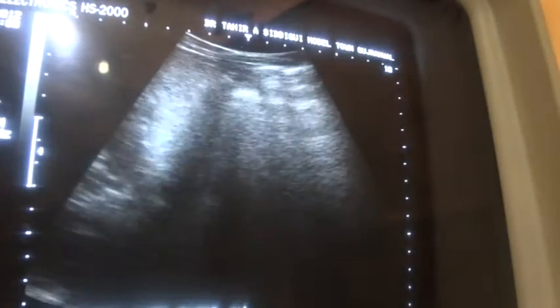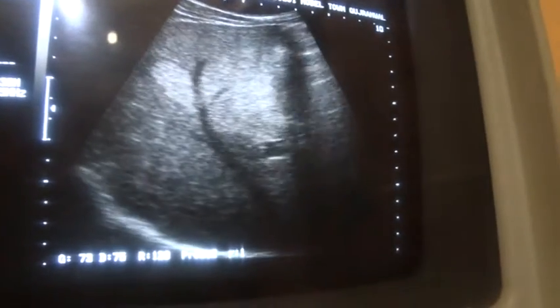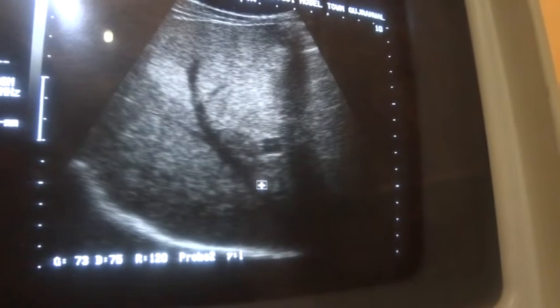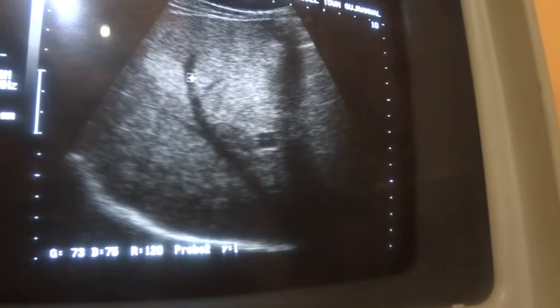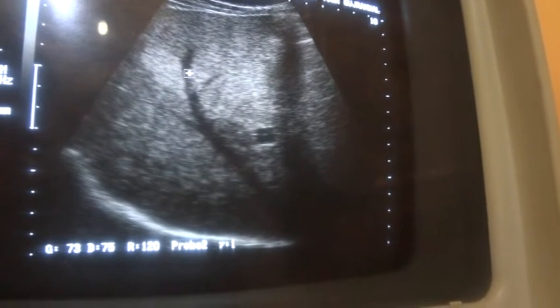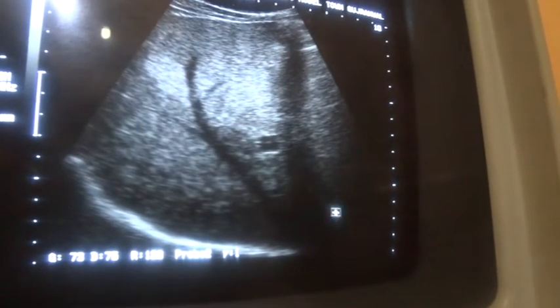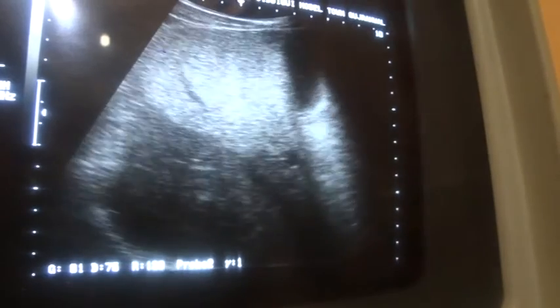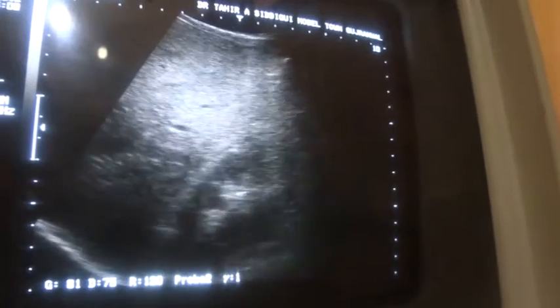The portion of the liver that has normal echogenicity, the vessel sharpness, see the vessels are very sharp in outline, and where the fatty patch intervenes, the outer surface of the liver becomes blurred. So this is a small patch seen. This type of liver is called a geographic liver, being partially fatty, partially normal.